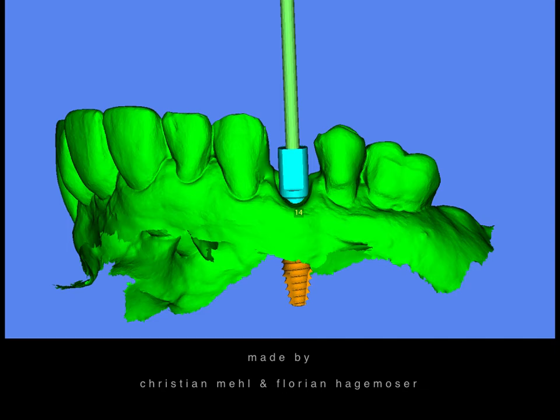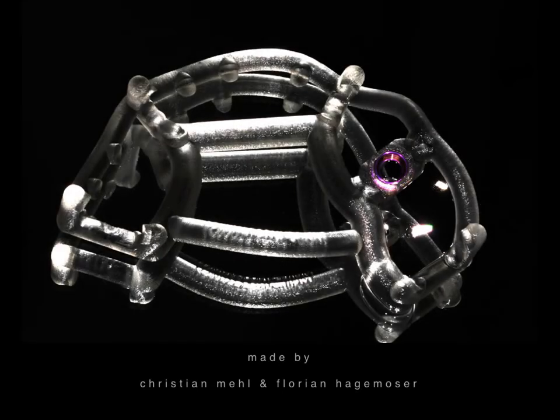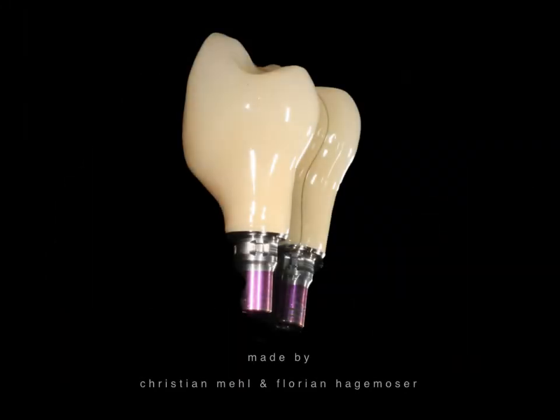Now we come to the interesting part of this presentation. The cool part with today's software is that you can place a virtual scan body onto the digitally pre-planned implant position, then export this file as an STL file and re-import it as if you have taken a digital impression in the patient's mouth. That allows you to pre-manufacture the temporary before you even start the operation. That's what we've done here, and that's what makes this case beautifully simple. This is the guide prepared for a 4.3 x 13 Chemlock progressive line implant, and the temporary was pre-manufactured before we placed the implant in the patient's mouth.